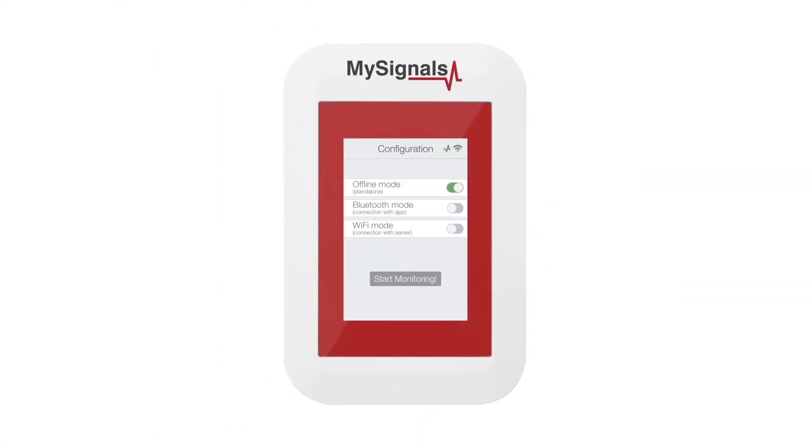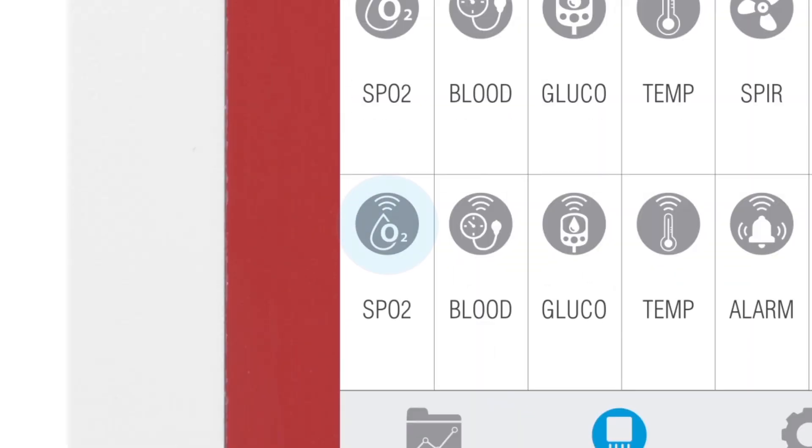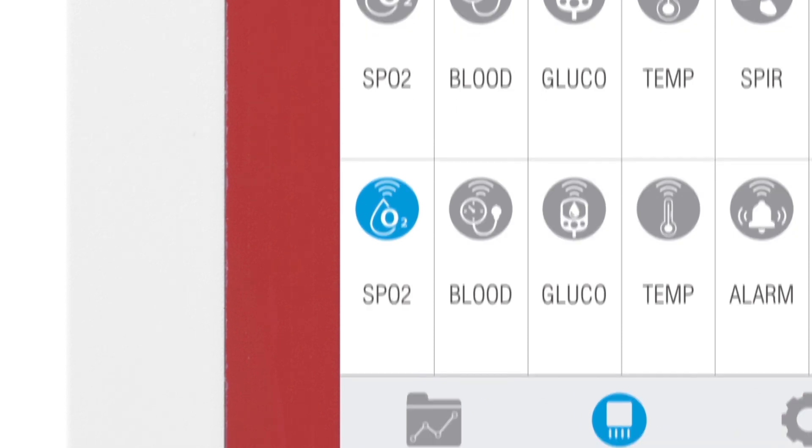In the Sensor Selection screen, you can see all the sensors available. By selecting the pulse and oxygen in blood Bluetooth low-energy sensor, the icon will turn blue.